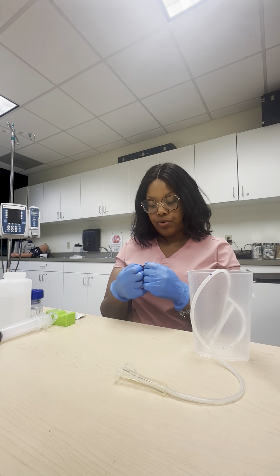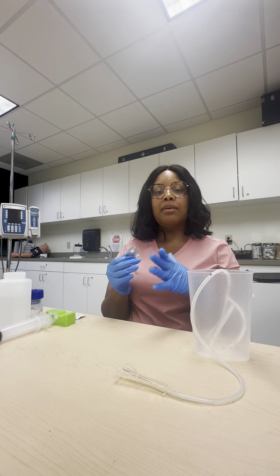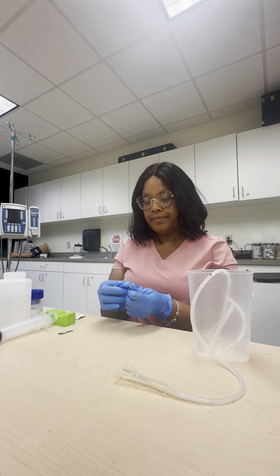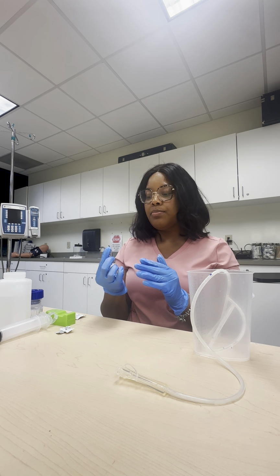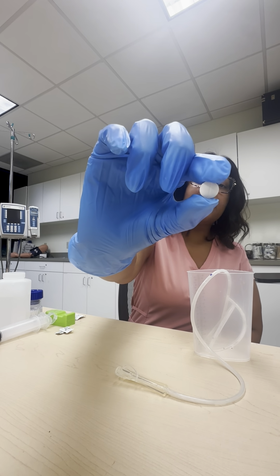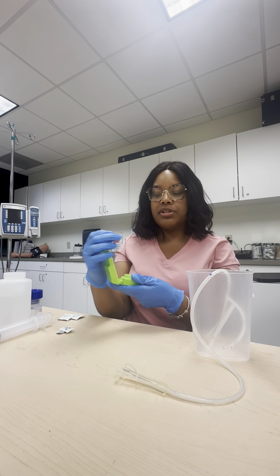So what we're going to do is I'm going to scan the medication, and the medical record, the MAR let me know that I'm supposed to give 5. So I'm going to open that medication, and I'm going to split it in half. So remember, your tabs have to be scored in order to split them. So if it doesn't have that line down the middle, you cannot be slicing the medication in half. So what we're going to do, make sure that your pill splitter is clean.